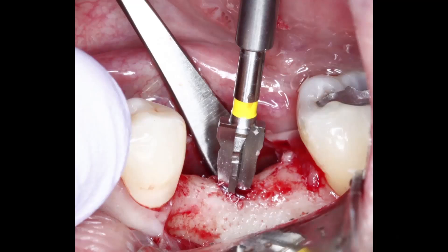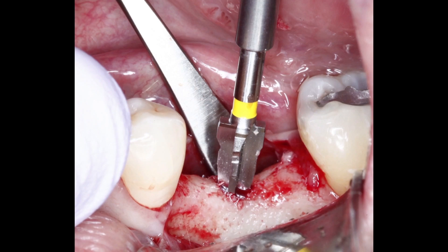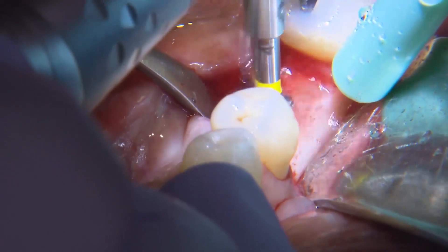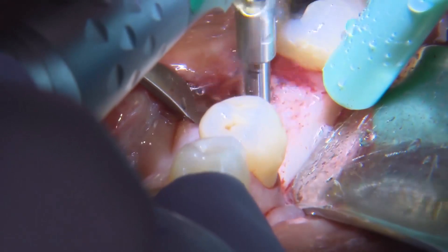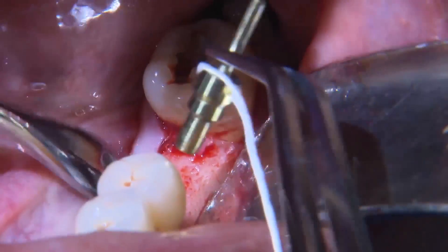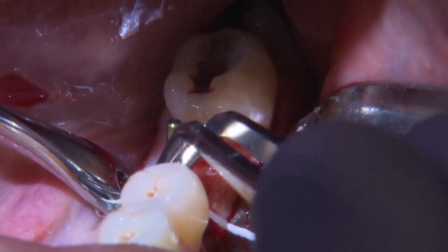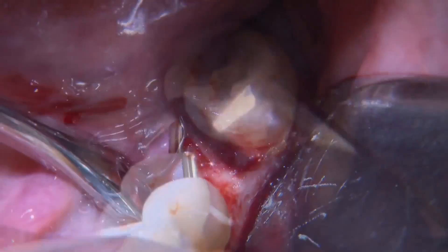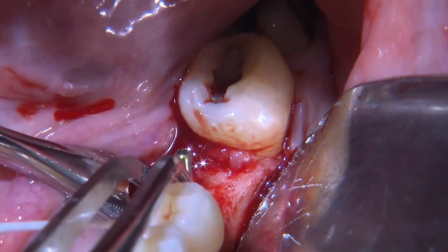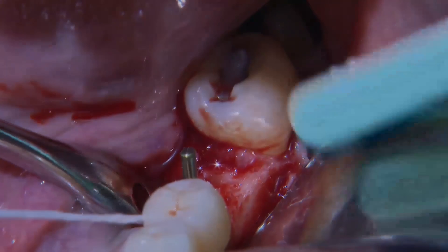You don't have to worry about depth because it's built into the shape of the drill. You just place the drill to the bone and you can predict how deep it is by where you place the drill into the osteotomy. I want to use my parallel pins at the next step in order to see whether I'm in the right direction and whether I need to change the angulation. It's really important to move up in drill sizes and give yourself a chance to correct the angulation if you are off-angled.